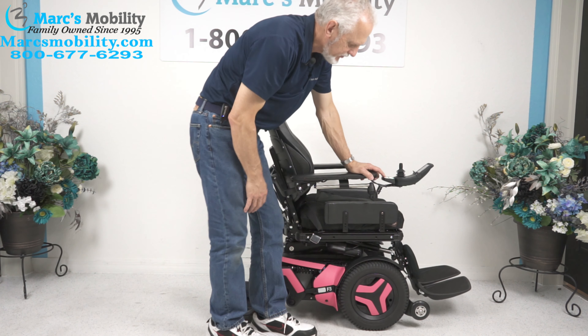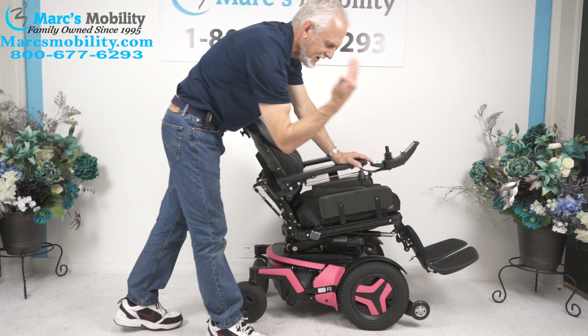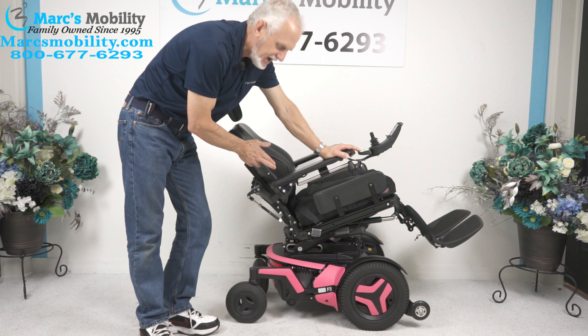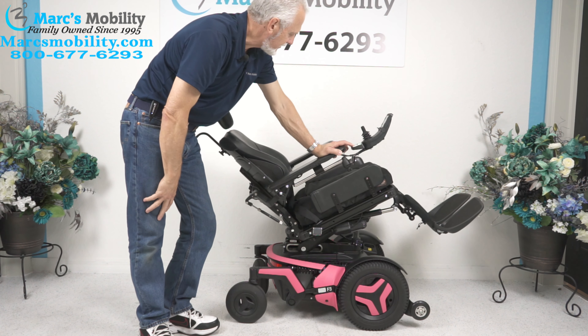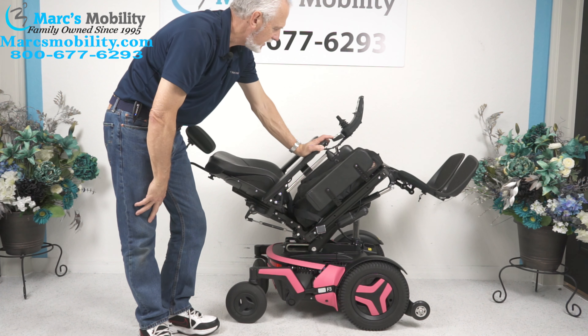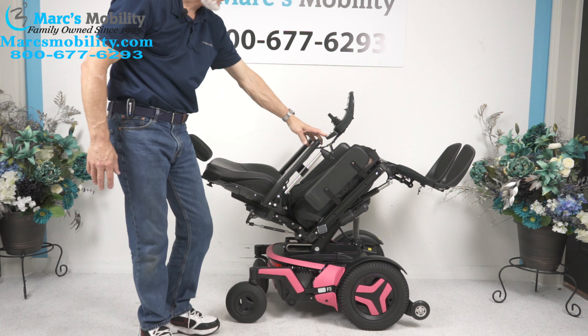The next option you have on your chair is called the tilt. The tilt is when this portion right here goes back. When this goes back, it's going to take the legs and the back because they're all connected together. That's called the electric tilt. We'll tilt it all the way — and that's as far as it'll go.